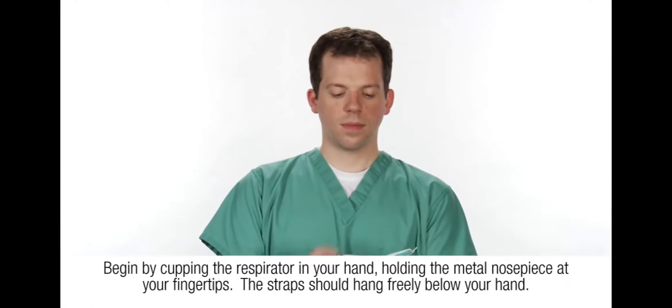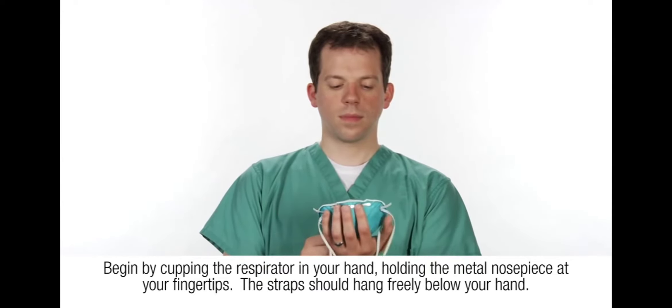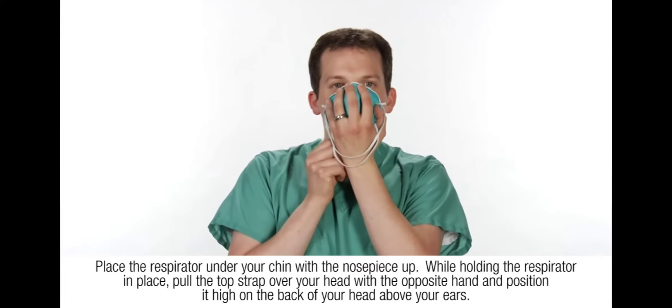Begin by cupping the respirator in your hand, holding the metal nose piece at your fingertips. The straps should hang freely below your hand. Place the respirator under your chin with the nose piece up.